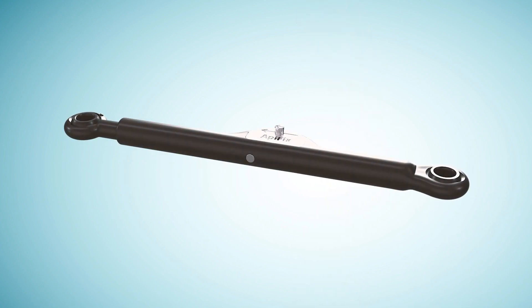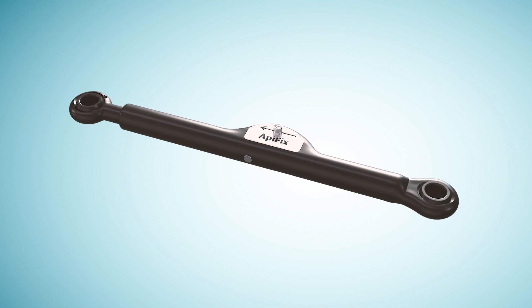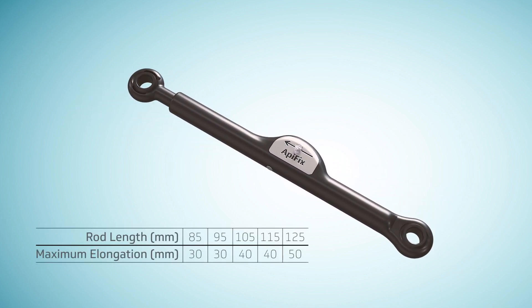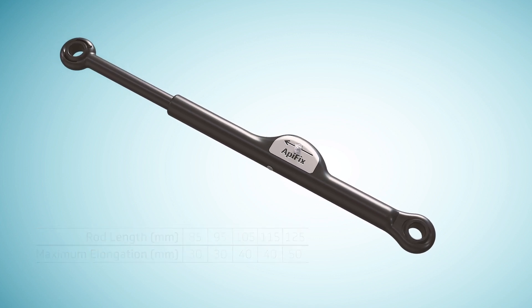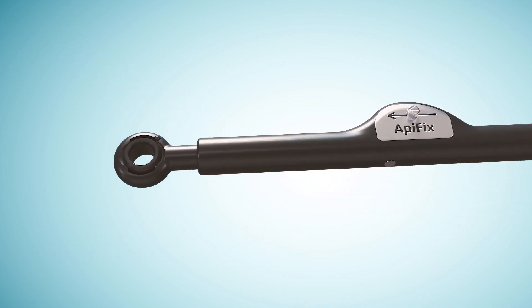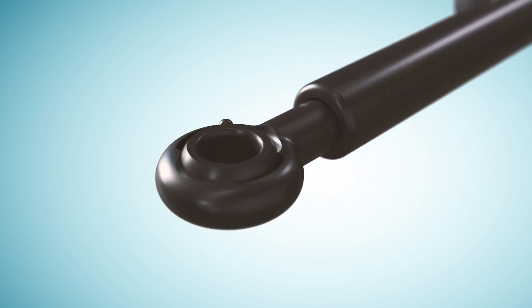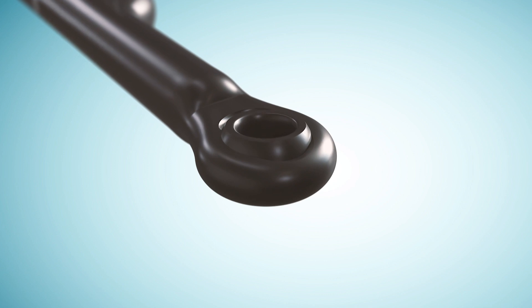The self-adjusting rod and extender are then prepared for insertion. The rod is available in a variety of lengths with each providing unidirectional elongation. The polyaxial joints at each end of the rod allow 40 degrees of spherical range of motion enabling near physiologic spine motion post-operatively.